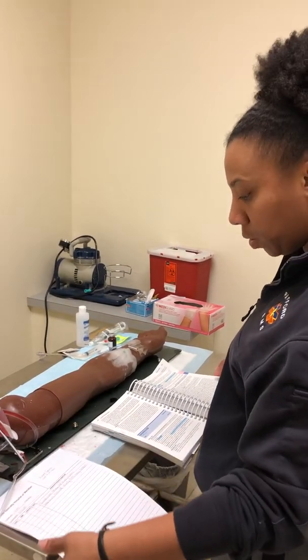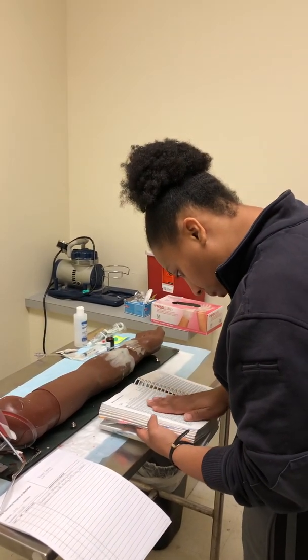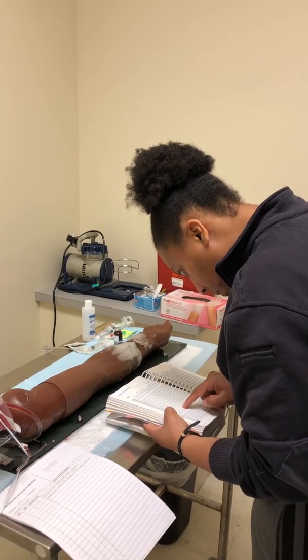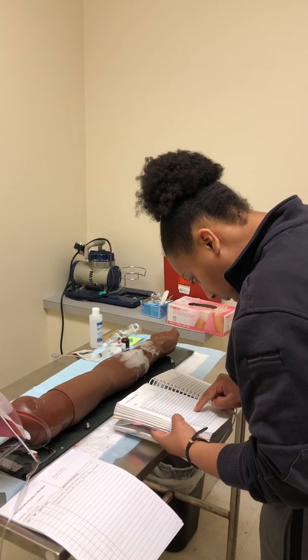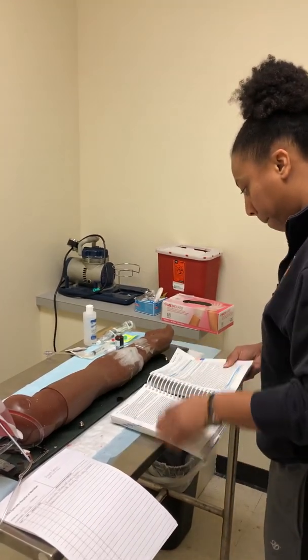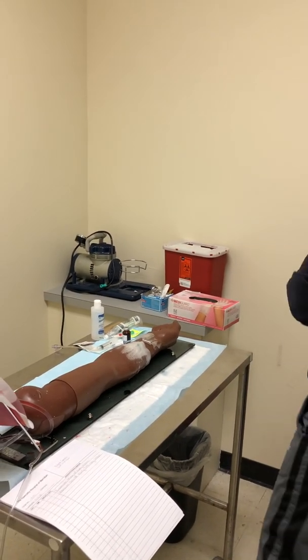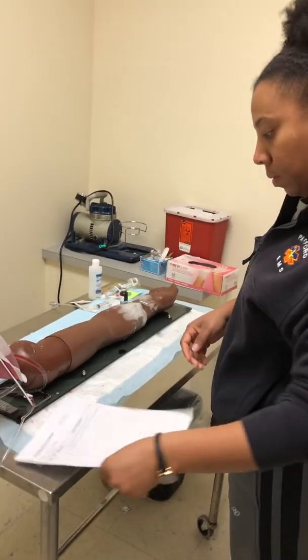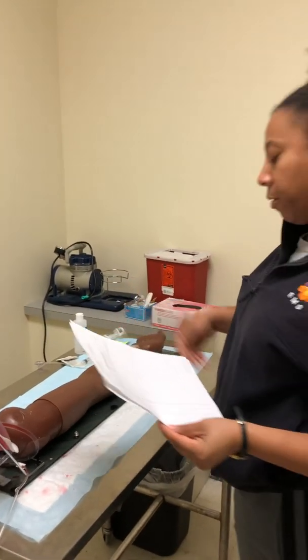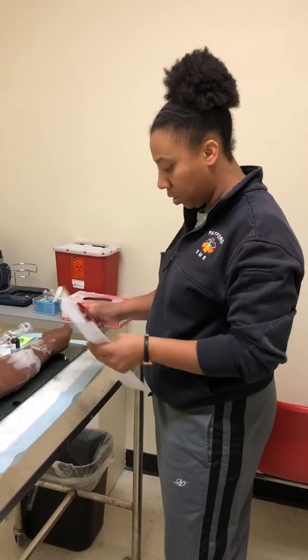I want to check the back of the book to make sure it's compatible. And it is compatible with LR. Okay. I'm going to set that over to the side. All right. At this time, I will calculate how much I'm going to give my patient. So I'll get a pen, do my calculation.